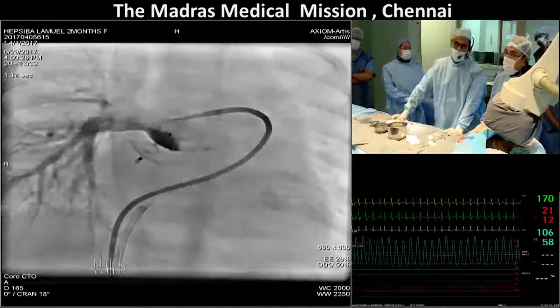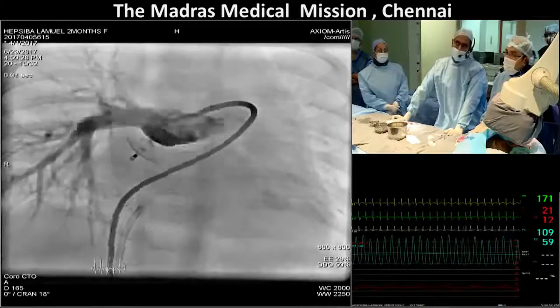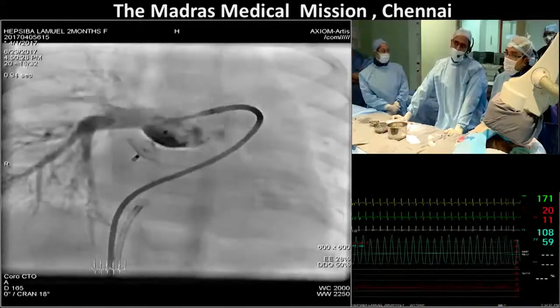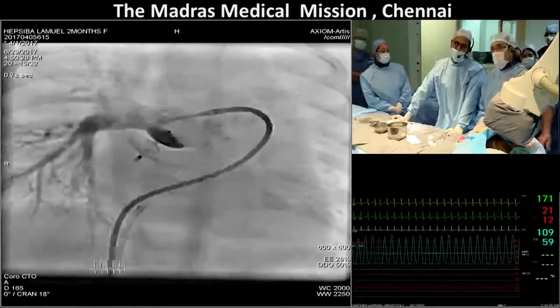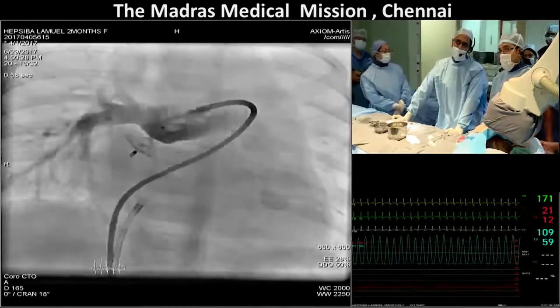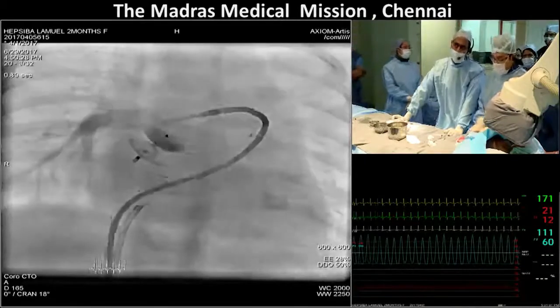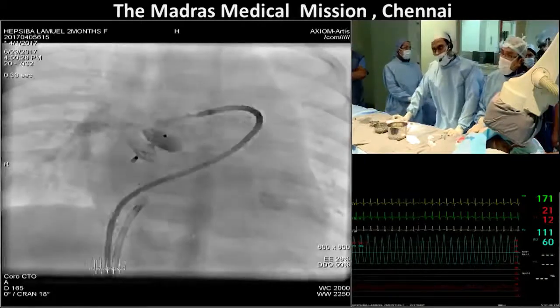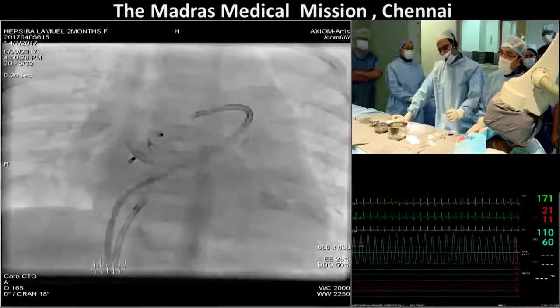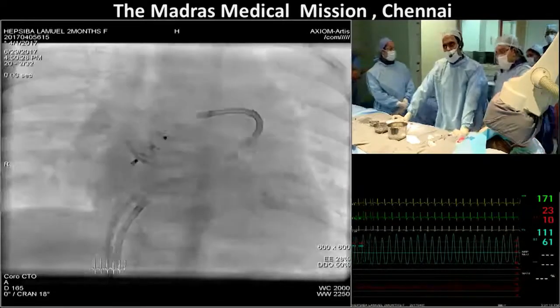We can see that the flow has almost stopped even now. Maybe there is a little bit of foaming. What will be interesting will be to decide on the antiplatelet or anticoagulation strategy. Now, Dr. Shan, who is my colleague, was presenting the different types of right pulmonary artery to left atrial windows.